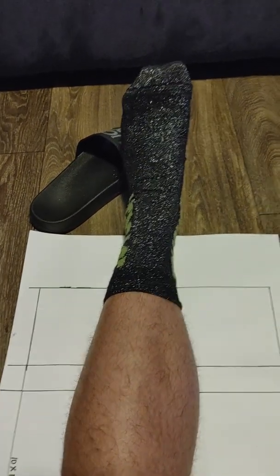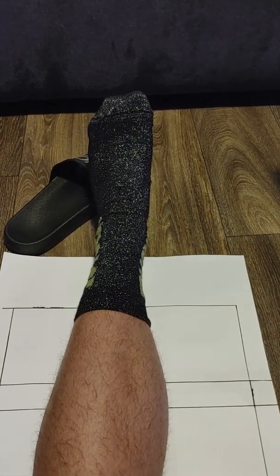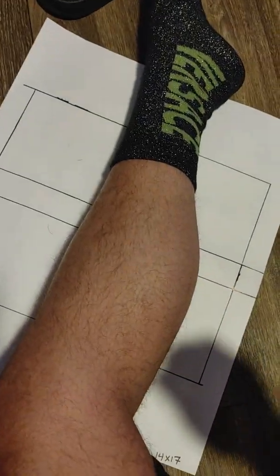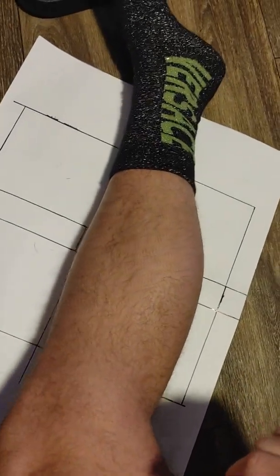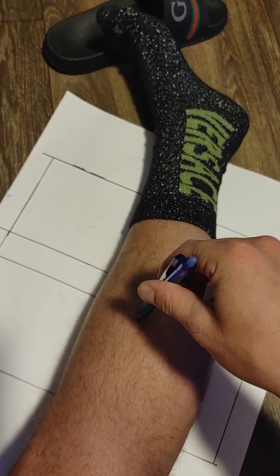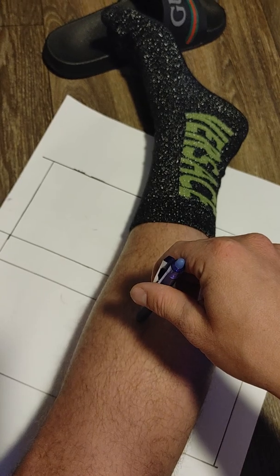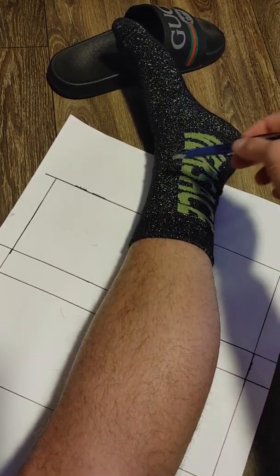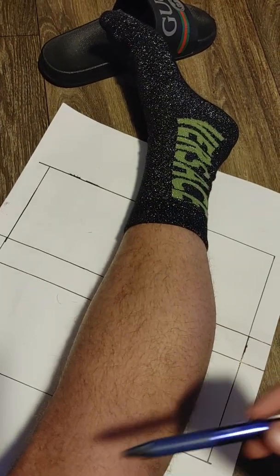Secondly, we're going to have the tibia and fibula lateral view. So I'll show as best I can here. It'll be like so. Again, the central ray would be directly at the tibia shaft. That's about it for that. We're going to collimate ankle and knee.